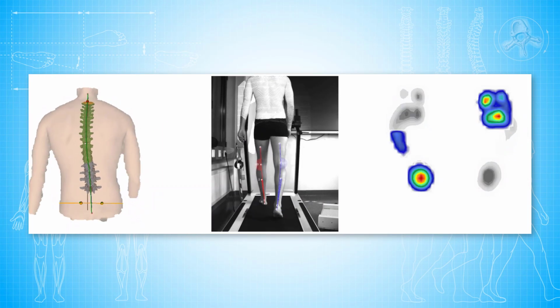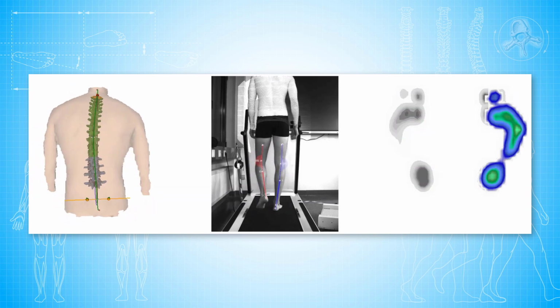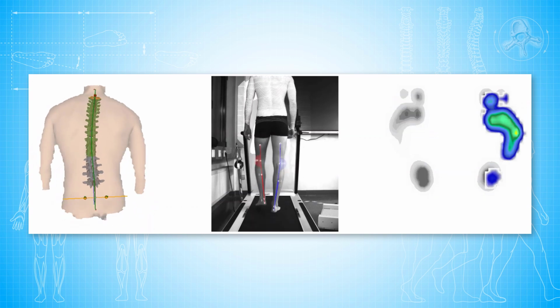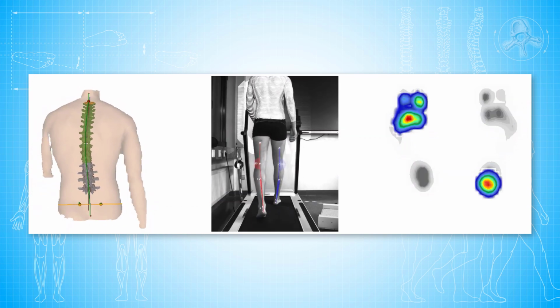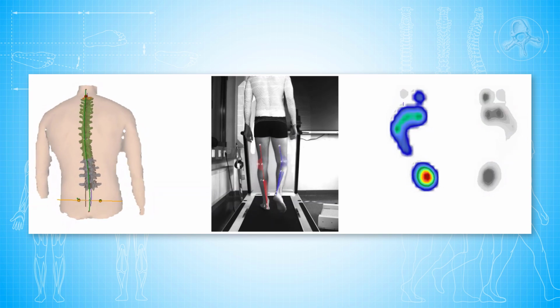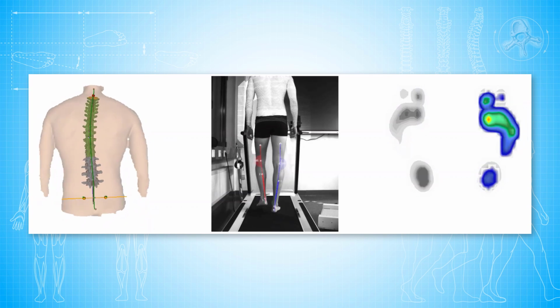Possible limitations resulting from the use of a treadmill are mainly of a coordinative nature. Lack of air resistance and the reverse spatial movement (the ground moves under me, I walk on the spot) often lead to an increased trunk inclination, a shortened stride length towards the end of the swing phase, and a compensatory increase of the stride frequency.